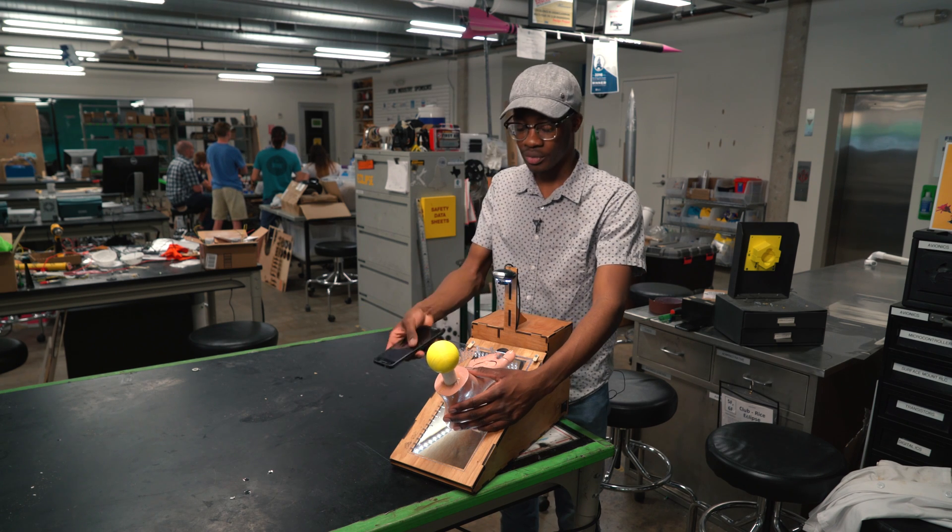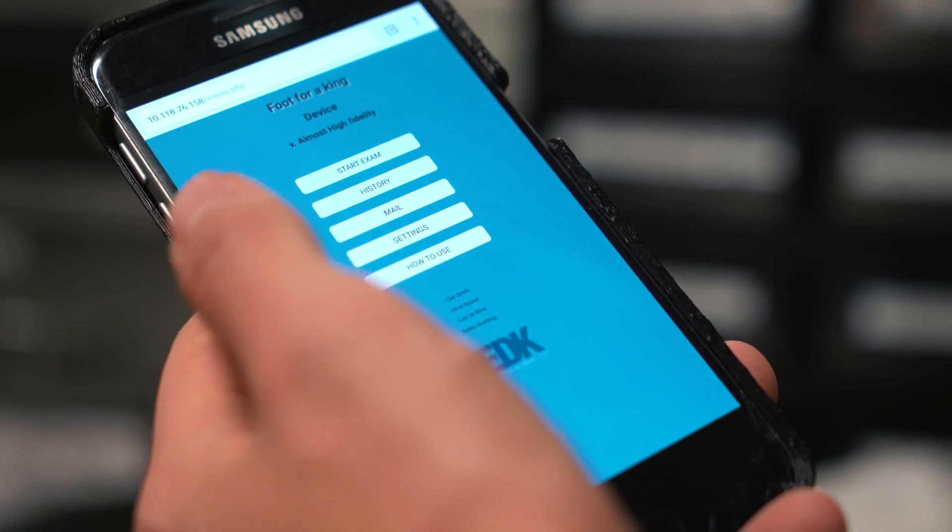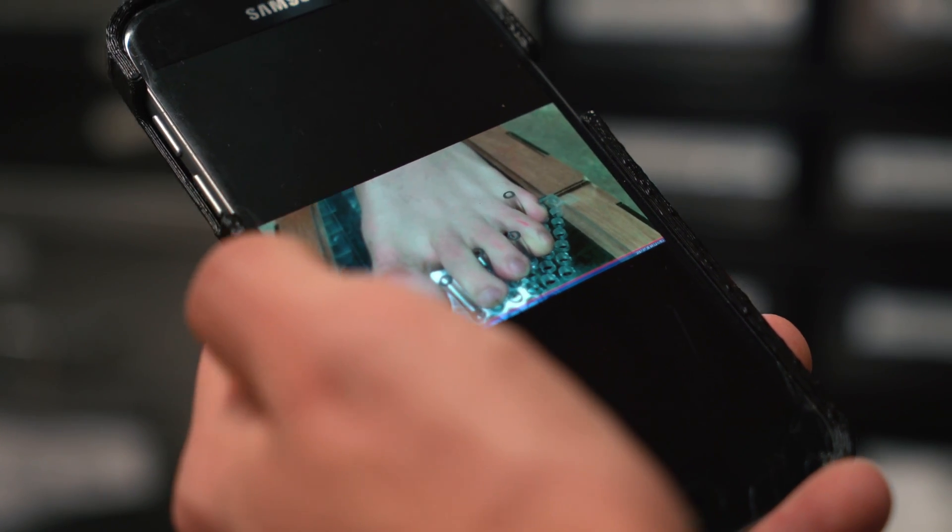You access the controls for the device on a webpage and you press the start exam button. The lights come on and the camera snaps a photo and sends it to you on the webpage.